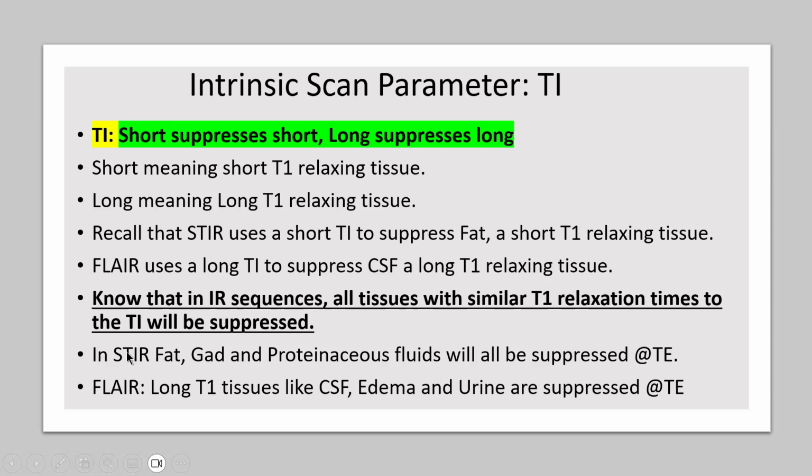So do you guys typically, I'm just going to throw this out there, run STIR after you give gadolinium? Probably not, right? You're sitting there going, oh, I don't know. I've never noticed. Well, next time you do a sequence that you're going to give GAD, you've probably done your STIRs first. Now, is that a rule?